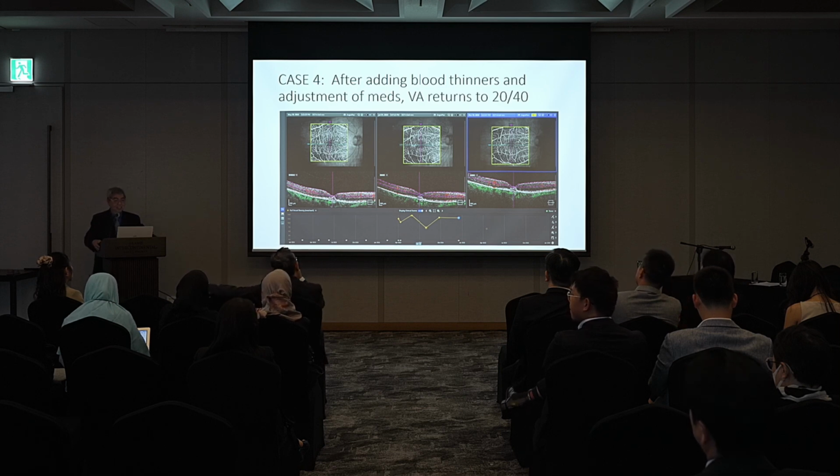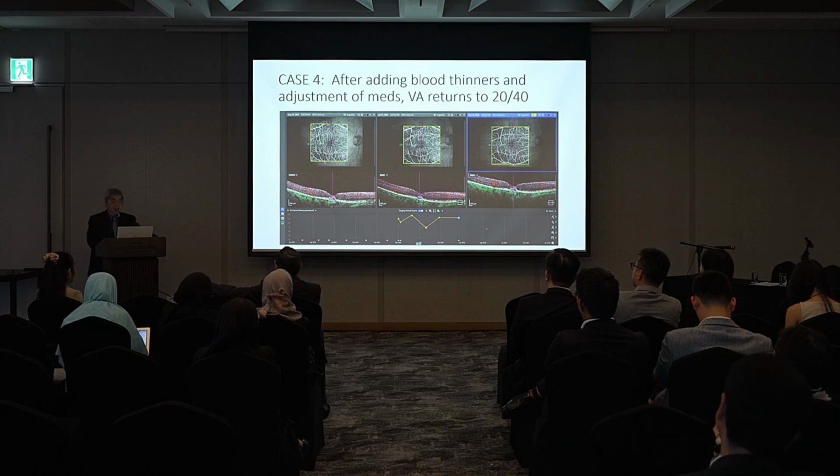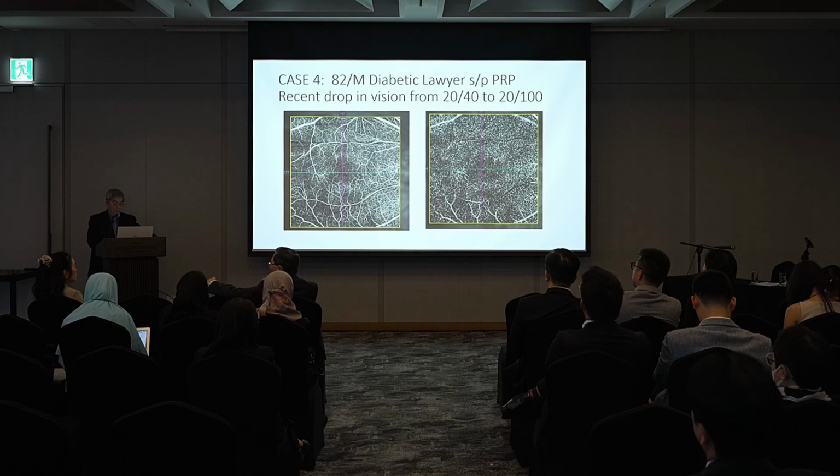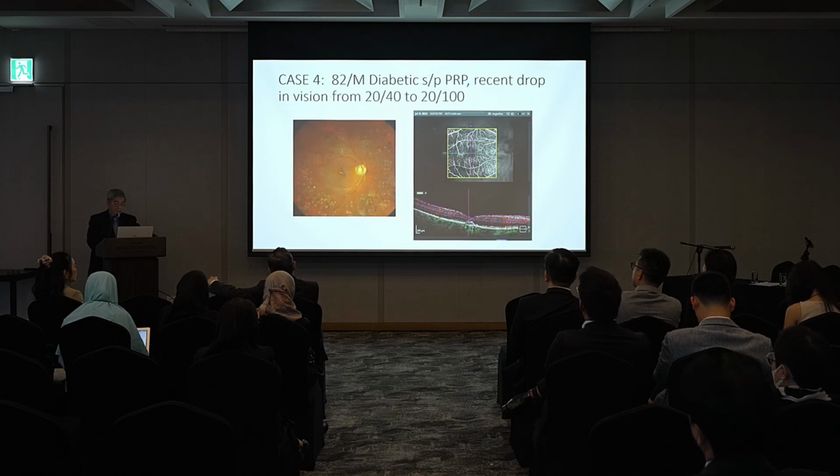Any thoughts, Adrian? I was just concerned that there would be small fronds of choroidal neovascularization, either iatrogenic or just a secondary CNV. And I would have watched the OCTA, bring the slab to the choriocapillaris, outer retina, very closely, and then watch him over about 2 to 4 weeks.